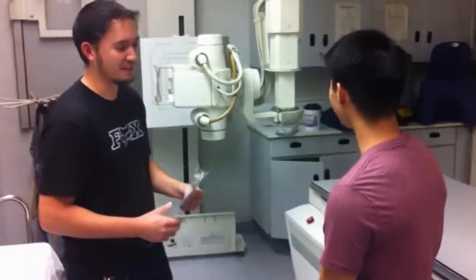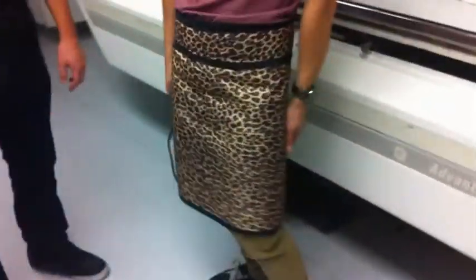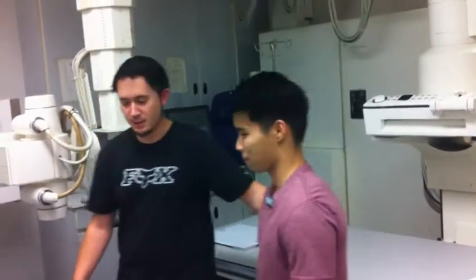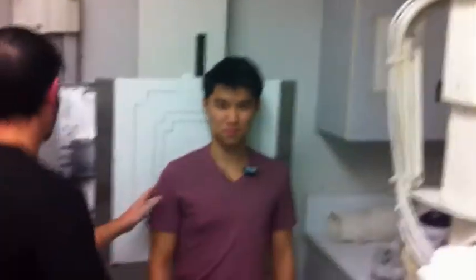So we got all that done with. We also got to put a little apron on here to protect his lowers from radiation. Sir, we're going to have you go ahead and step in front of the bucky there, facing me. Sorry, roll forward. What we're going to do is put the 10 by 12 inside.